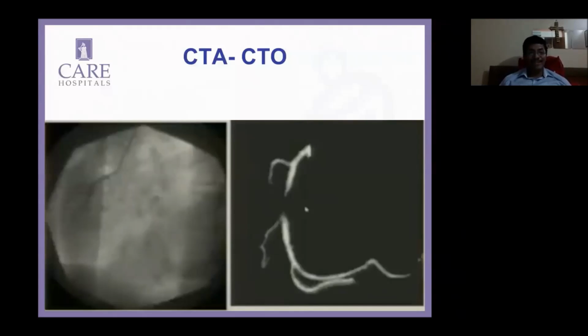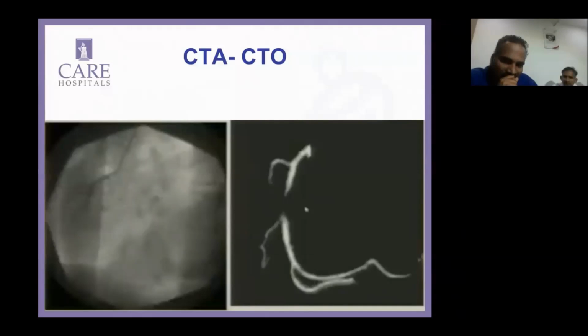The second thing is we don't want to be competing with the people doing CT angio and increasing our radiation scores, which we are not reporting, by the way. Yes, sir. My one take home with this is, though we can't see a distal vessel in conventional angiogram, we can still see a good vessel in CT angiogram. This is a good take home point.